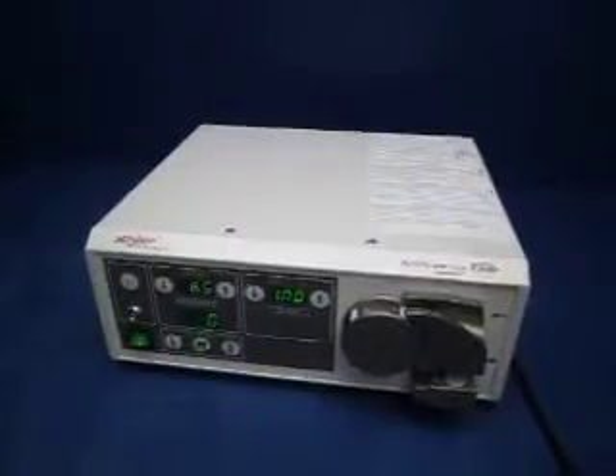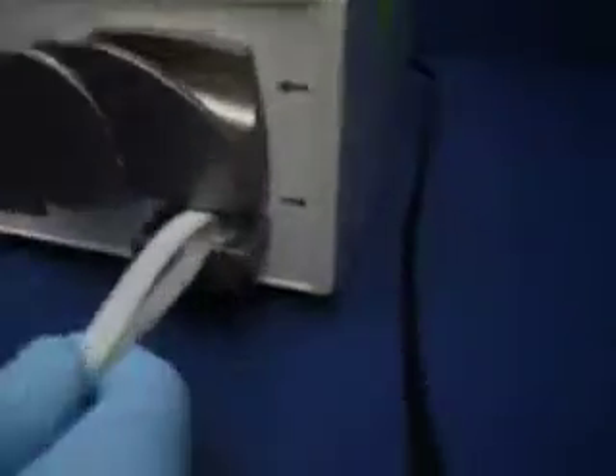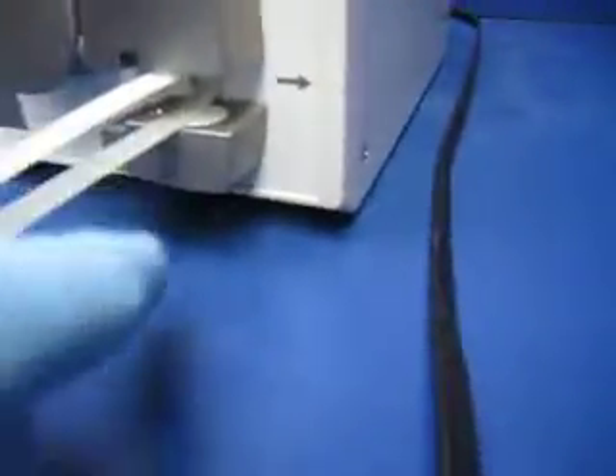This is our Stryker arthroscopy pump. We're going to use this to cheat the system into thinking there's a cartridge installed, so that'll push the sensor.